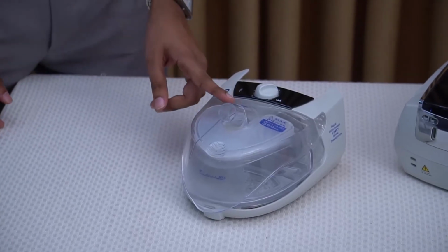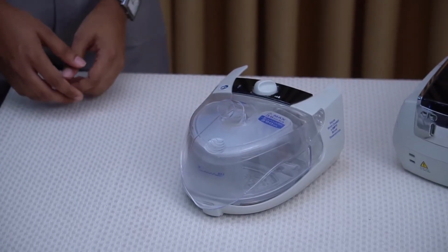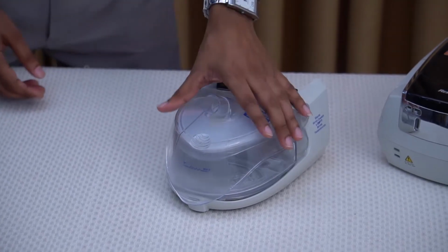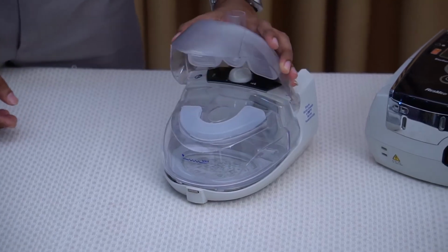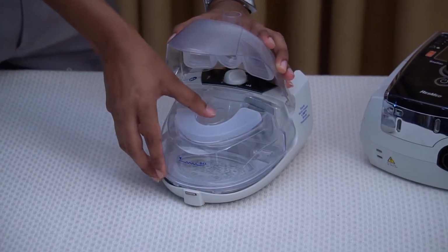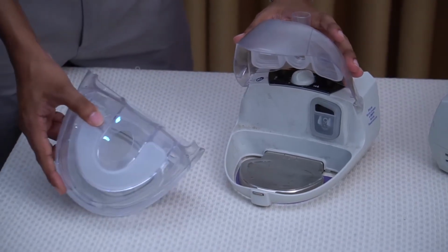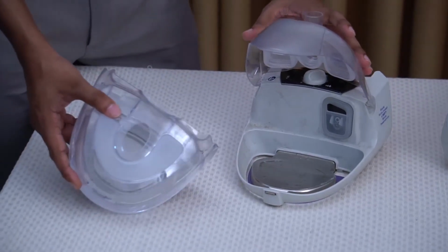Humidifier. This is a plastic part containing a container to store water. This lid can be opened and the water container can be taken out. We need to add sterile water to the container up to the level shown here.